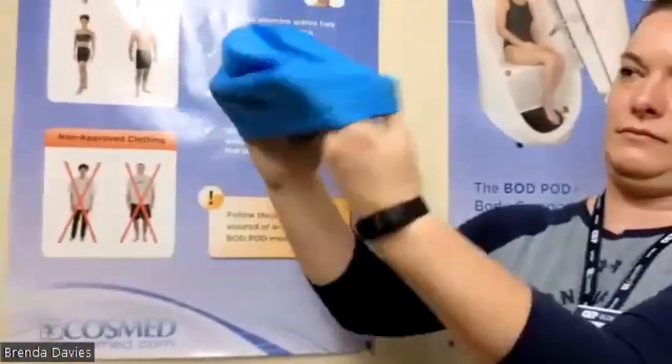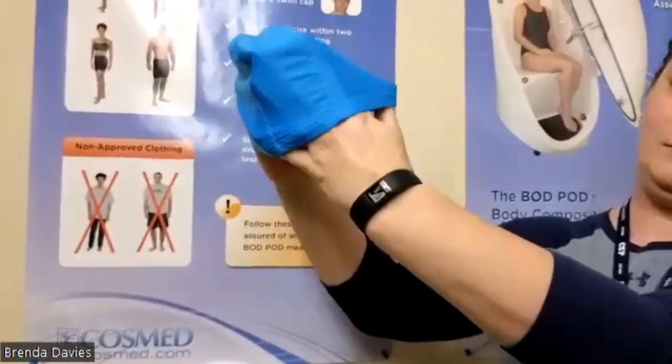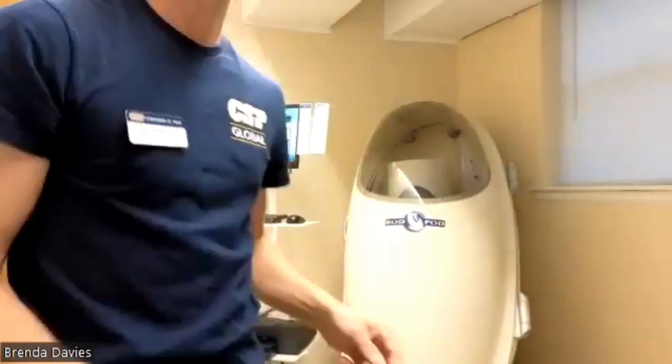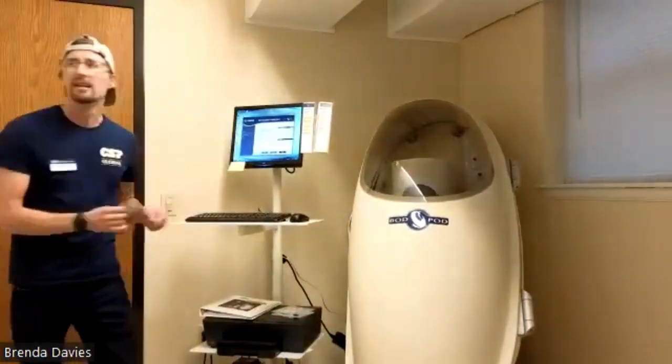You also want to make sure that they have a swim cap to compress the air that's in the hair of the individual. And so we're going to have that for Anna as she's going to get ready for the Bod Pod.